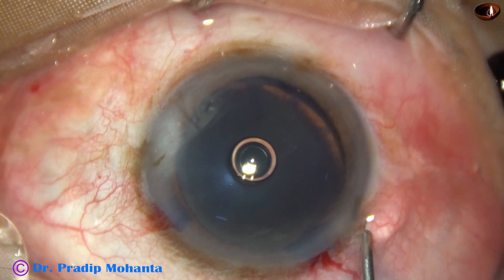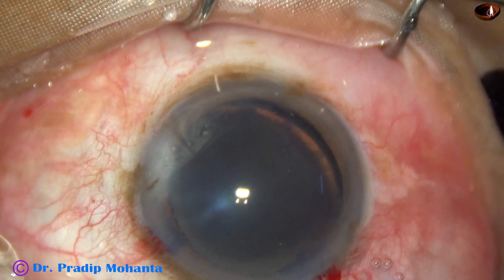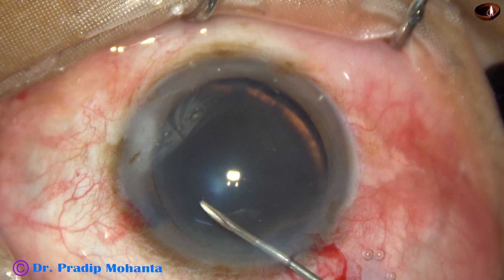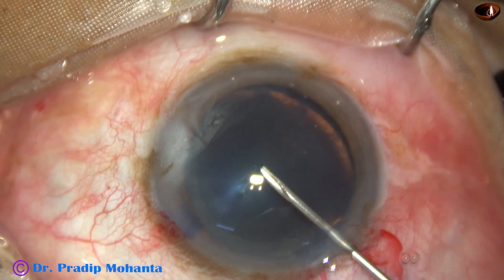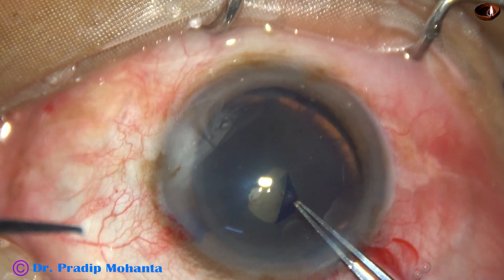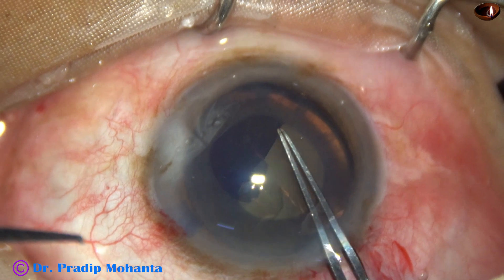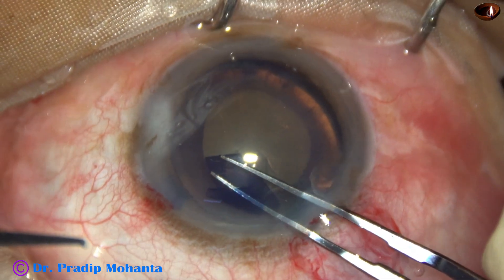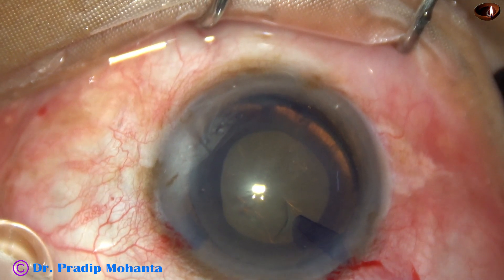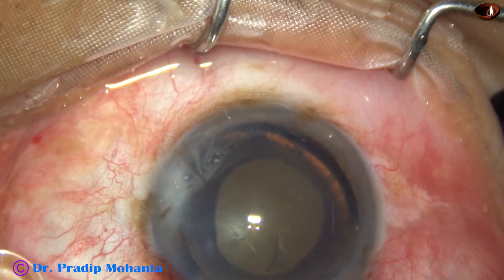The anterior chamber is filled with 2% hydroxypropylmethylcellulose, and a 26-gauge bent needle cystitome is taken. The anterior capsule is incised from 11 o'clock to the center. The capsular tag is held with utrata forceps and capsulorhexis is done. I aim for a small rhexis because there is a zonular defect from 5 o'clock to 9 o'clock, but from 12 o'clock to 3 o'clock I go a little peripherally so that the size of the rhexis becomes optimum.